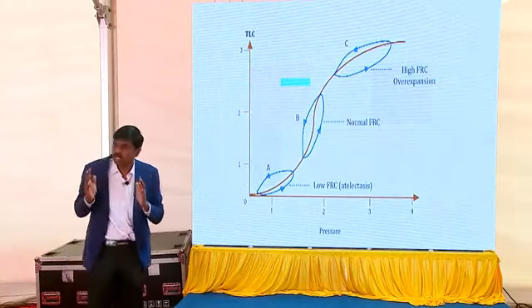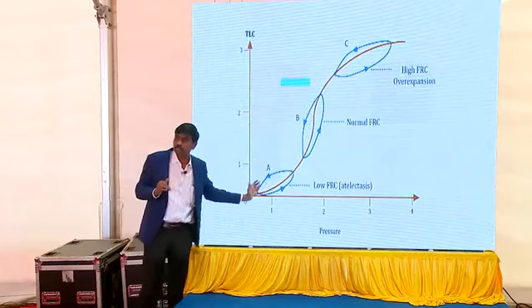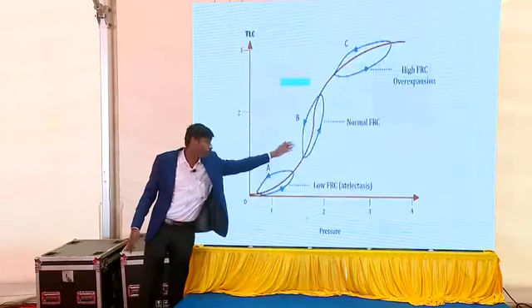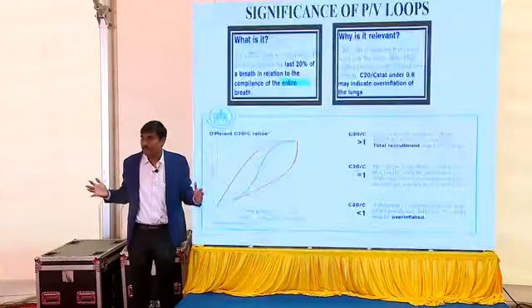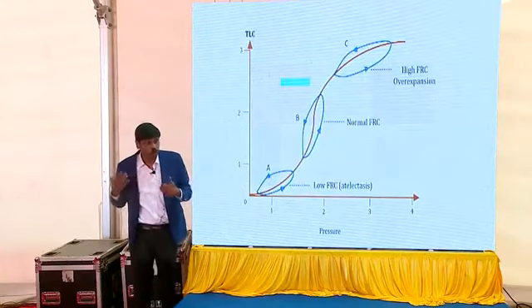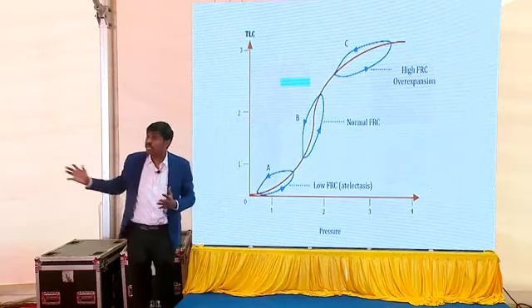Now, what does this signify? This signifies that you give a little more PEEP so that you ensure your lung is already open here. Beyond that, whatever PEEP you give will ensure that your lungs open well. Otherwise, what happens if you give less PEEP? You need more pressure to drive the air inside, which is more counterproductive. Your lung is again going to collapse, and again you're going to open it up. So that's going to be counterproductive.